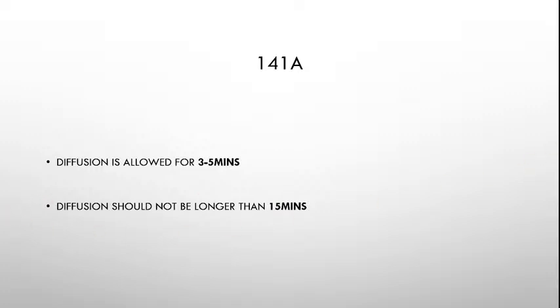Paano ko malalaman, sir, kung talagang nag-diffuse na siya? Kasi ilalagay mo sa incubator. Sa incubator kasi, the purpose of incubation is not only to provide the optimum or the ideal temperature requirements, but also to consistently dry what is supposed to be dried inside. So, nag-start na yung drying process nun. Okay, so basically, the diffusion process is at a standstill once you put your agar in the incubator.